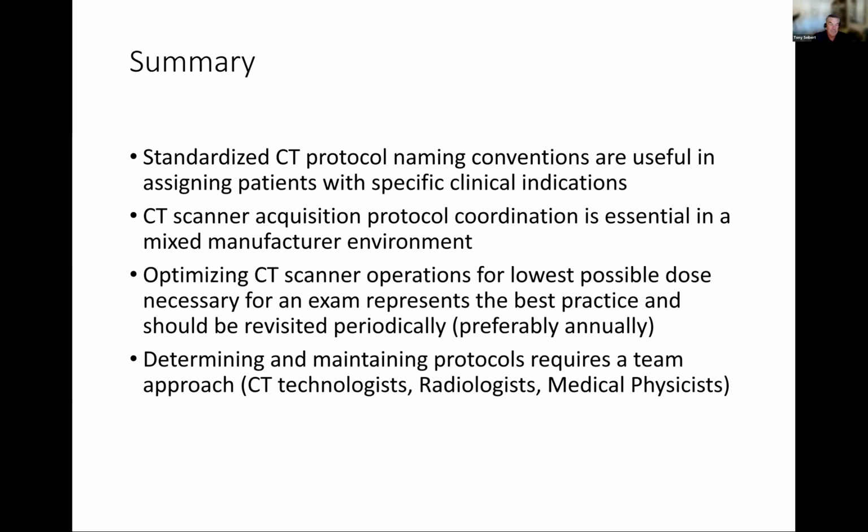So in summary, and to finalize, standardized CT protocol naming conventions, as shown, are very useful in assigning patients with specific clinical indications. CT scanner acquisition protocol coordination is essential. Optimizing CT scanner operations for the lowest possible dose without affecting diagnostic accuracy should be revisited periodically, which is typically on an annual basis, and determining, implementing, and maintaining protocols requires a team approach, including CT technologists, radiologists, and medical physicists.